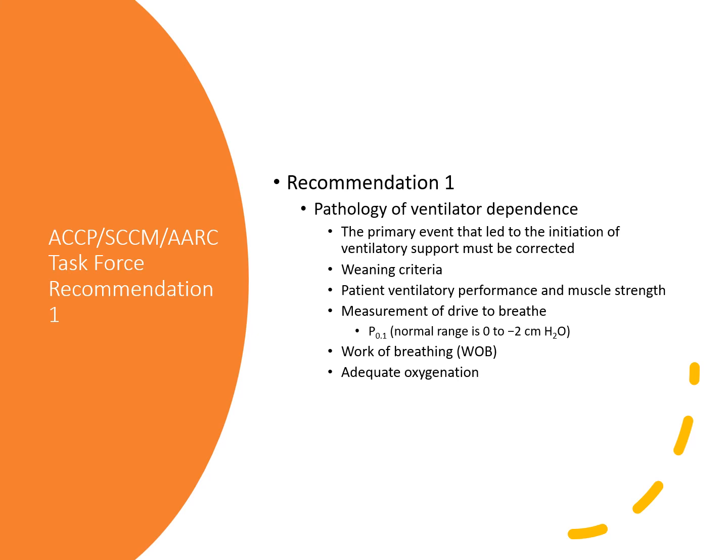But anyway, some people will do this with CPAP and pressure support, but the RSBI should be less than 105. The normal range is 60 to 105, but values above 105 usually suggest the patient's not ready for weaning and probably would fail a weaning trial.